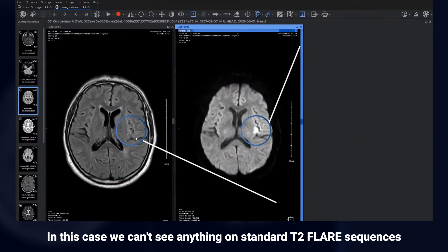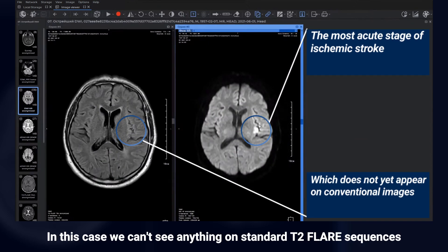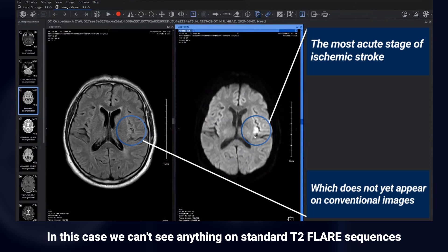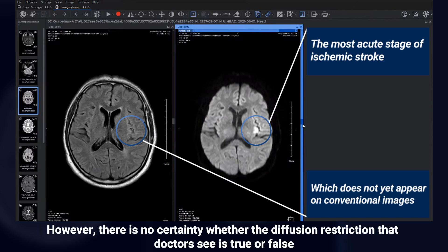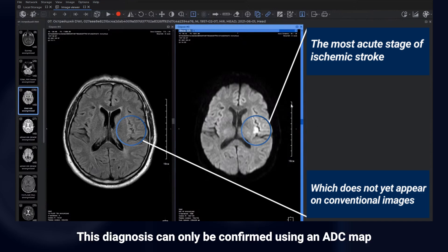In this case, we can't see anything on standard T2 FLAIR sequences, but the diffusion-weighted image indicates an acute stage of ischemic stroke. However, there is no certainty whether the diffusion restriction that doctors see is true or false. This diagnosis can only be confirmed using an ADC map.